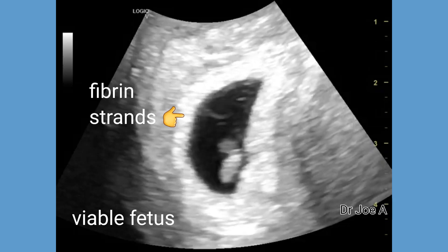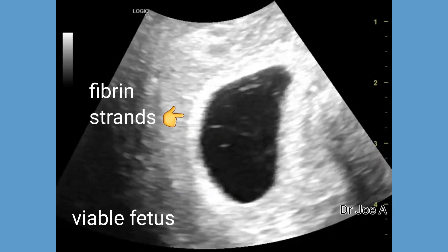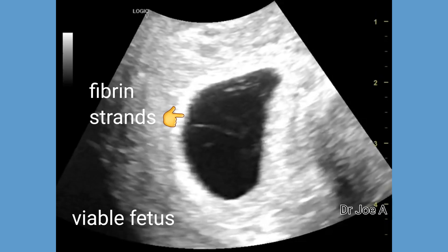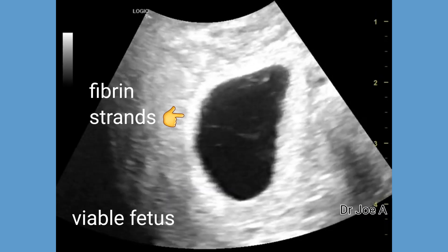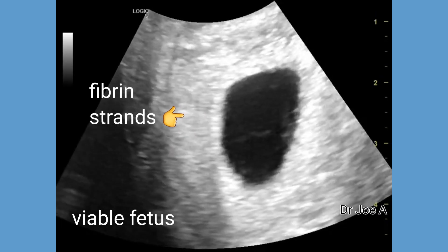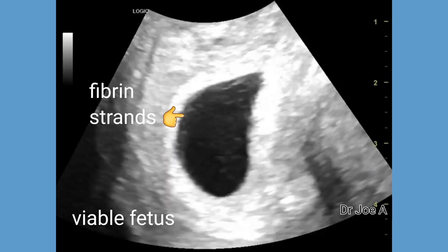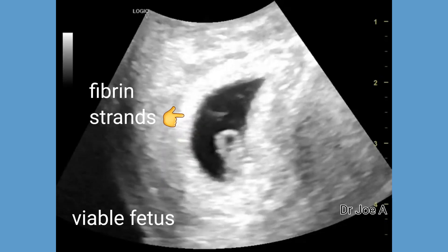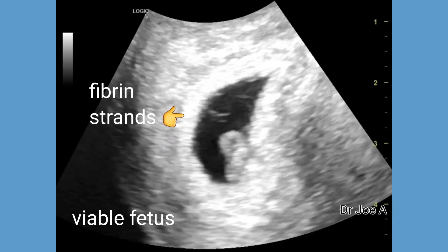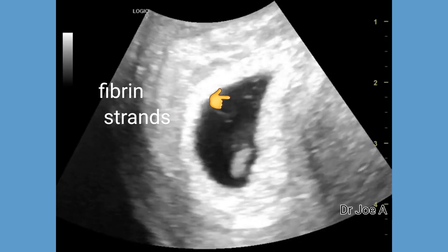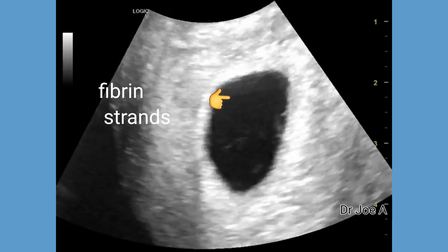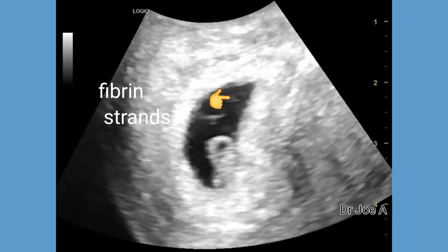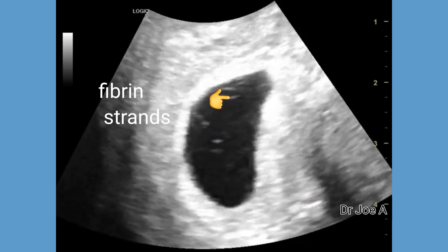What are fibrin strands? These are thin strands of fibrin that can be seen within the gestational sac. Their presence is not uncommon and is generally considered a normal finding in early pregnancy. They are thought to be the result of a normal breakdown of the embryonic membranes. Also, improvements in the resolution of trans-vaginal ultrasound transducers have made them easily visible.